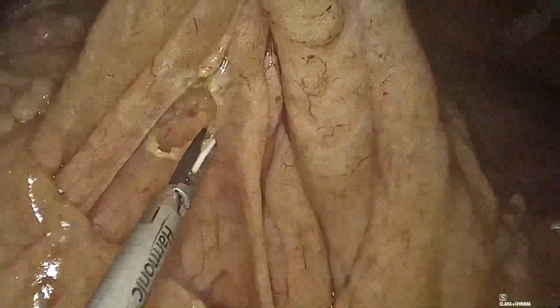In between the dissection, a suprapancreatic window was created for suprapancreatic dissection to reach the lesser sac.